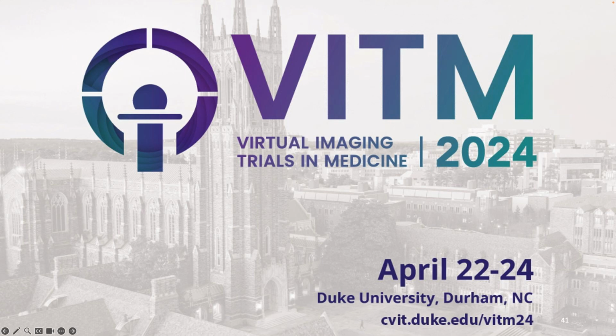In fact, FDA and University of Pennsylvania demonstrated that for a clinical trial comparing digital mammography versus digital tomosynthesis, another imaging modality for breasts, they could have used a virtual trial to predict that comparison, showing that digital mammography is better for calcification, and digital tomosynthesis is better for lesion detection.